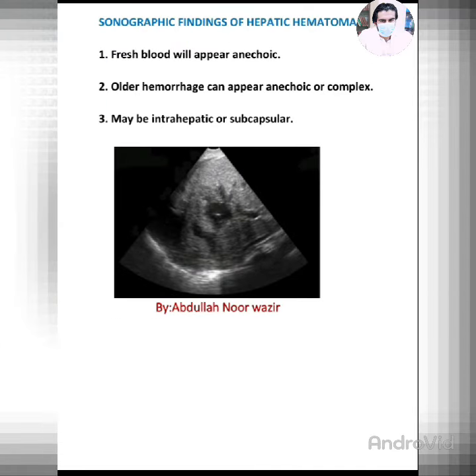The sonographic findings of a hepatic hematoma. First, a fresh hematoma will appear anechoic due to the full penetration of ultrasound waves. Second, an old hematoma may appear complex or anechoic. Complex is that area of hematoma where the blood has become clotted.